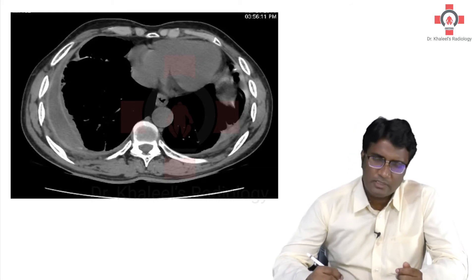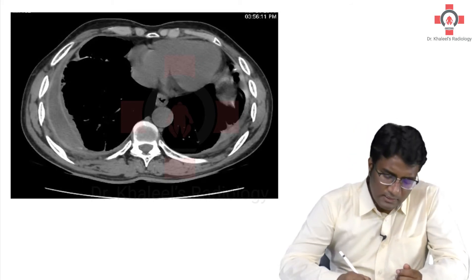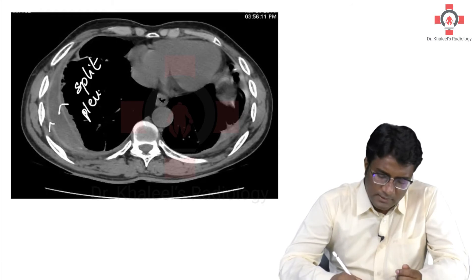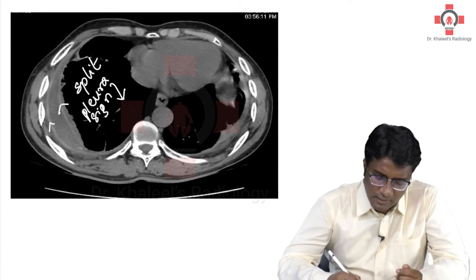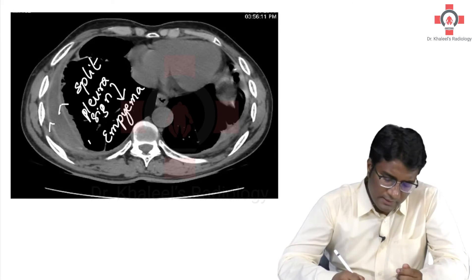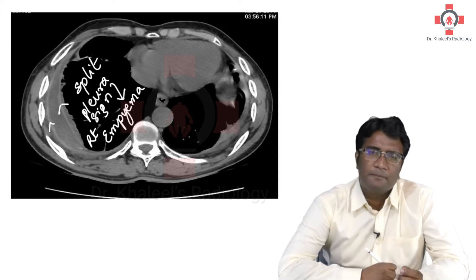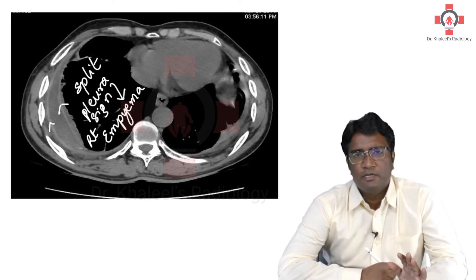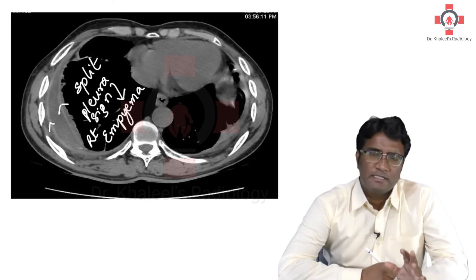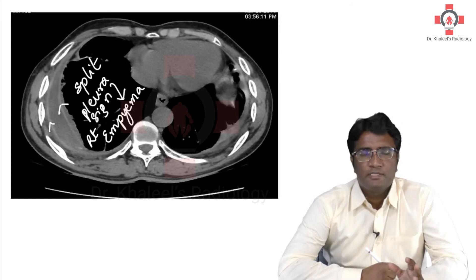This collection is causing thickening and splitting of the pleural layers. So this is called the split pleural sign, and the split pleural sign is a feature of empyema. So this is a case of right-sided empyema. If there is only homogeneous fluid without pleural thickening, I would call it right pleural effusion, but if you are seeing a split pleural sign, this is empyema.